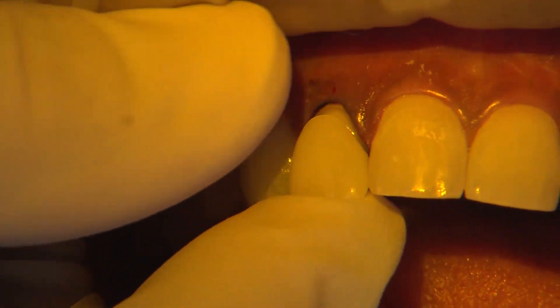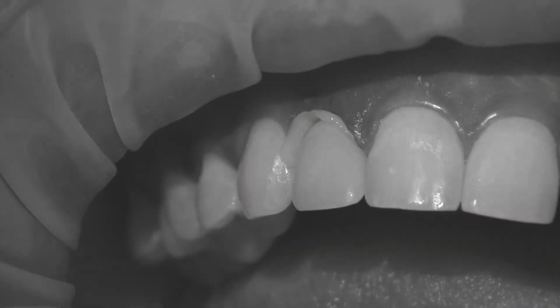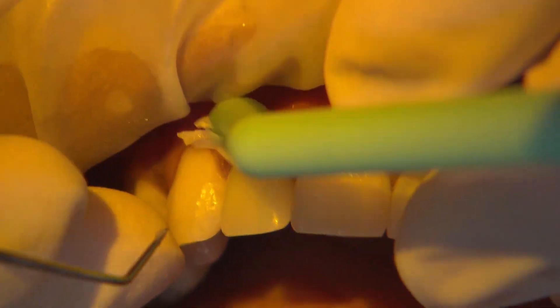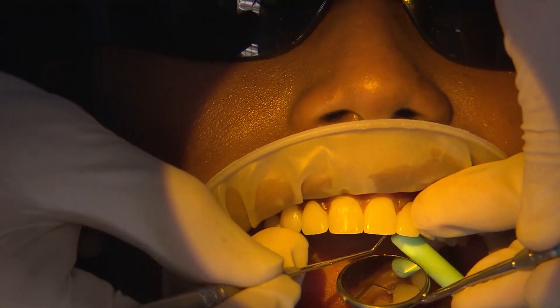Then OptiBond Universal Adhesive is scrubbed on both preps, air-thinned and cured. The restorations are loaded with clear Kerr NX-3 Adhesive Resin Cement and then seated into place.